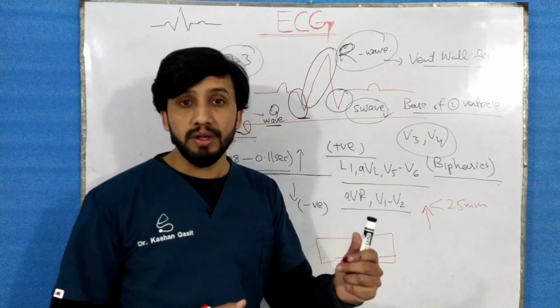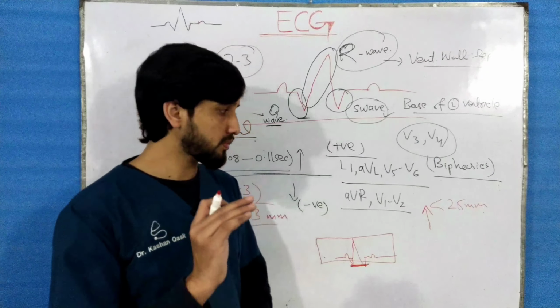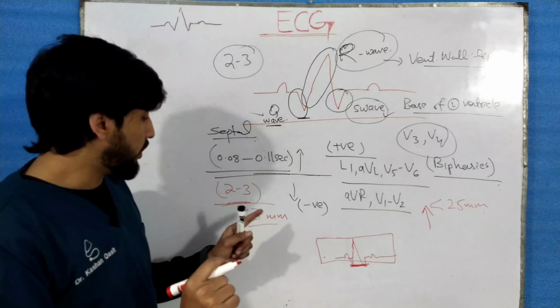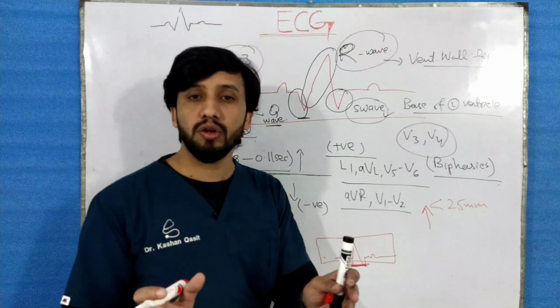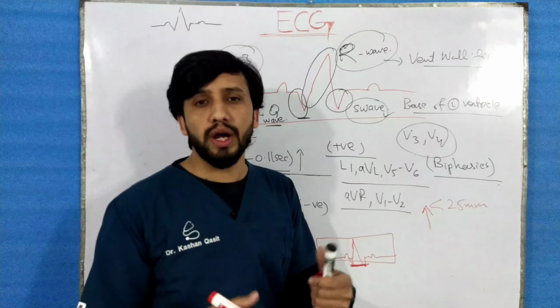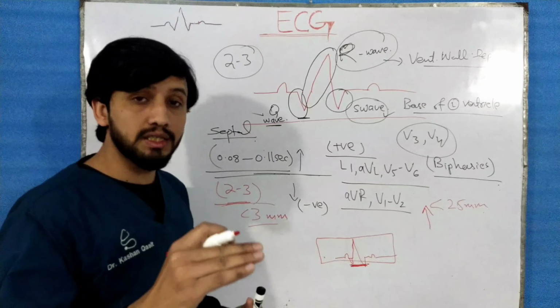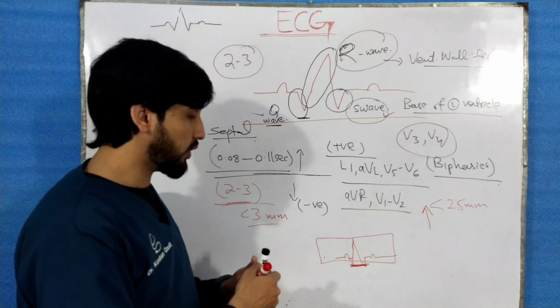The last thing we will be discussing here is the abnormalities of the QRS complex. When it is greater than or less than this duration, you will say that the QRS complex is abnormal, which may be due to any heart condition, or there will be abnormalities. We will discuss all these abnormalities later. So coming towards the abnormalities of the QRS complex.